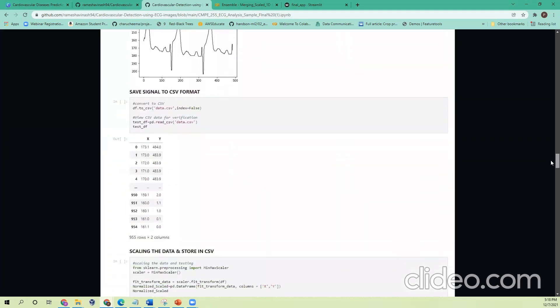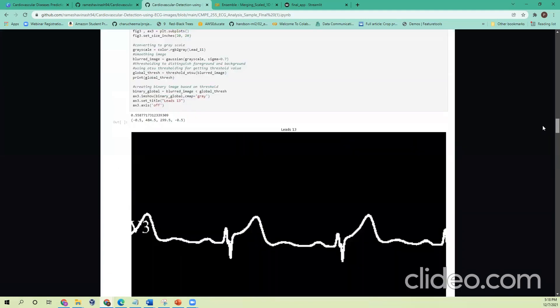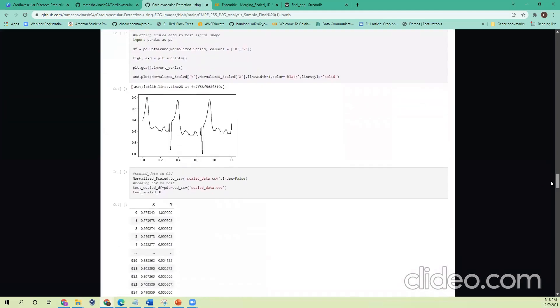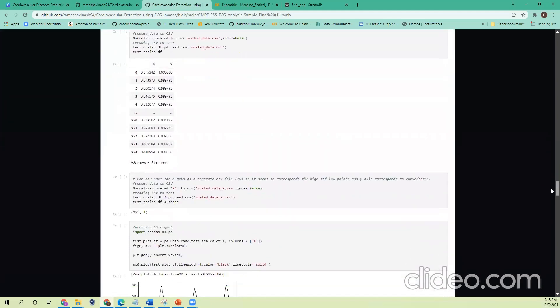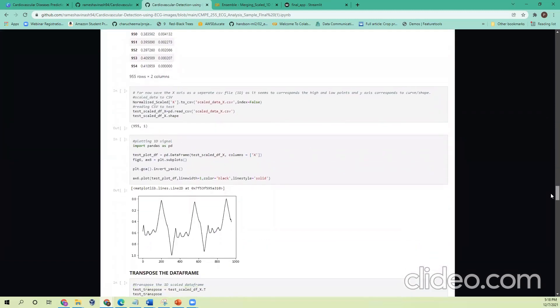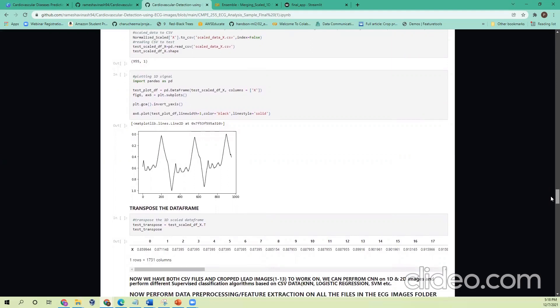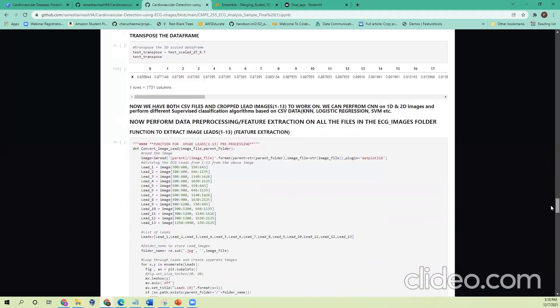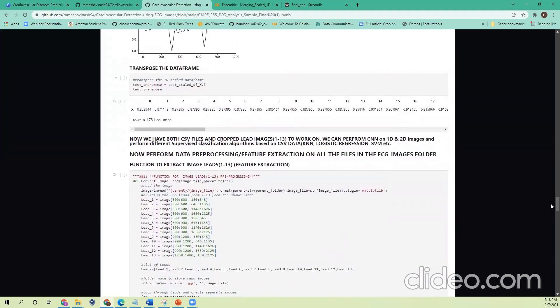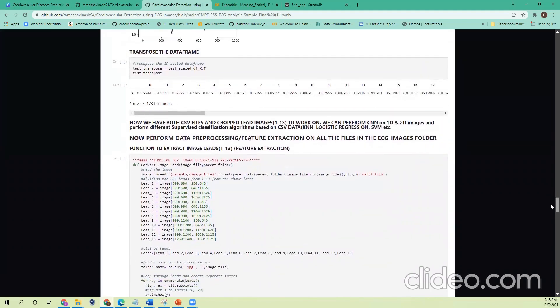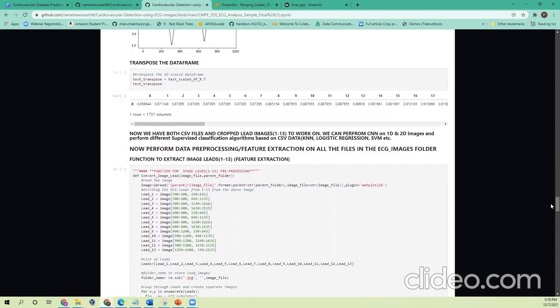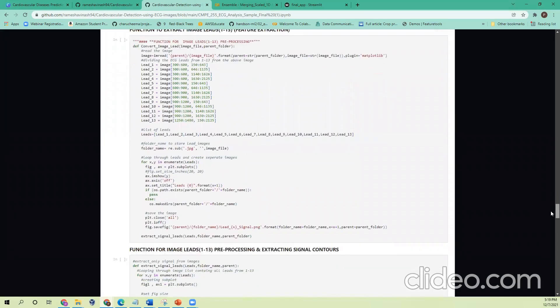Once we have the exact signal, we save it in a CSV file. We first convert it into a 2D signal — basically a 2D array consisting of x and y points. We found that only the x points are sufficient for processing since they contain the peak values of the image, so we excluded the y value and kept only a 1D array. We then normalize using MinMax scaler so that the values are within a specific range. One major problem we faced was the processing time — it took many hours due to limited compute power.